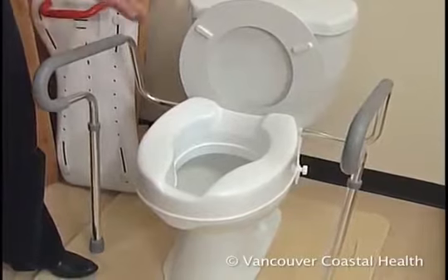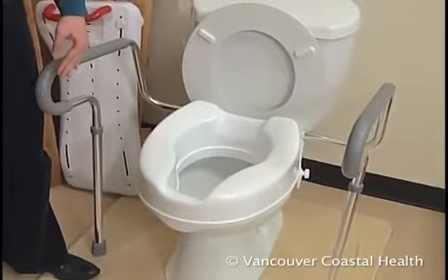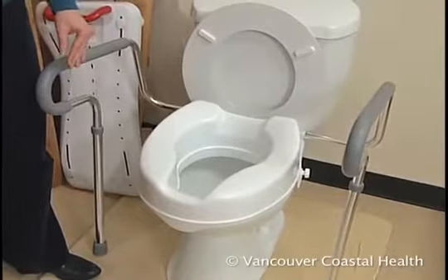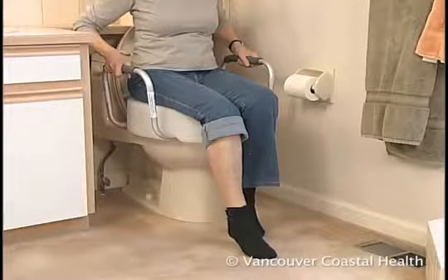It's important to support your arms when getting on and off the toilet. You can attach to the wall a safety frame that fits around the toilet, or some raised toilet seats have built-in armrests.